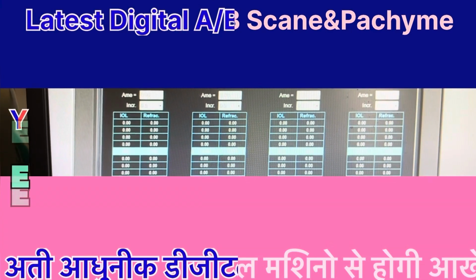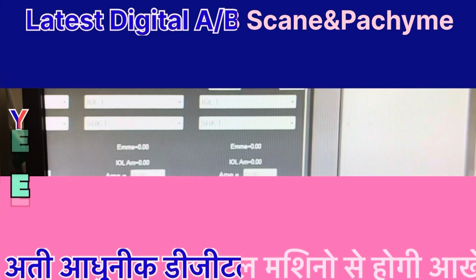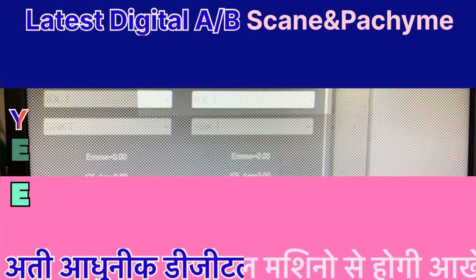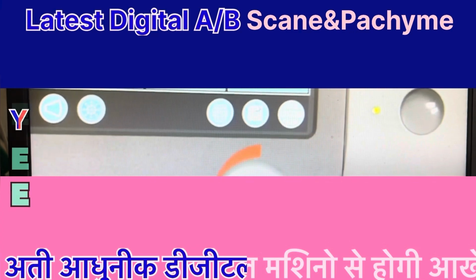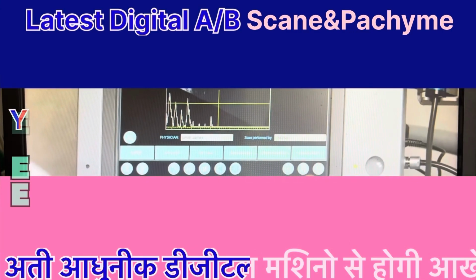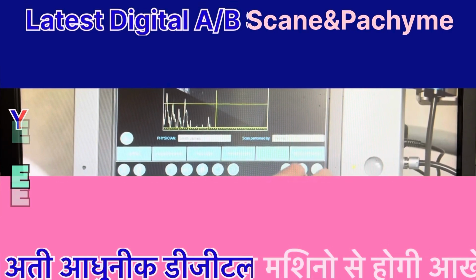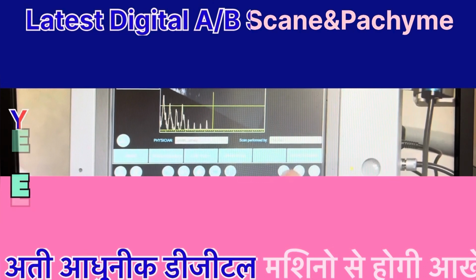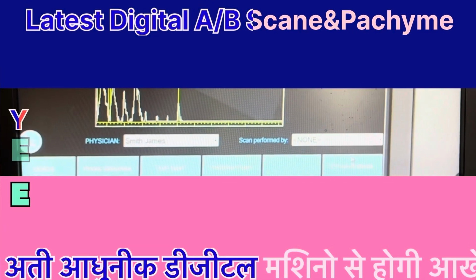The IOL calculation screen displays calculation results for 4 IOLs. The examiner can choose different IOLs to display from the IOL pull-down menu in each result table, and calculation formulas can be modified via the formula pull-down. For post-refractive surgery cases, different IOL calculation methods are accessible via the Method pull-down menu in the top right-hand corner of the screen. Results can be saved by touching the Save icon at the bottom or printed by selecting Print.